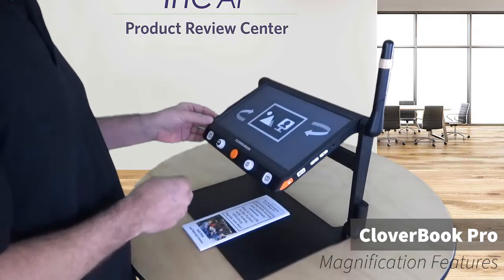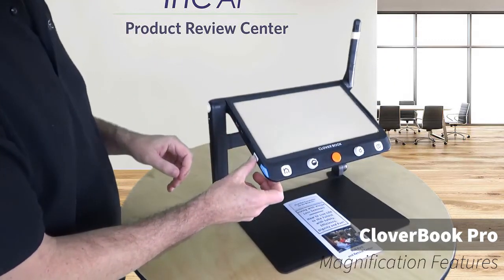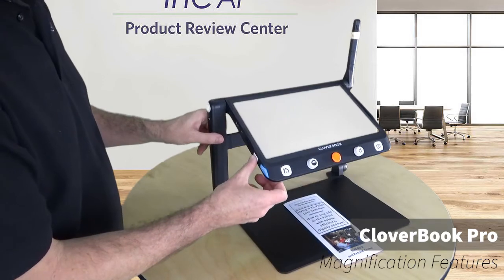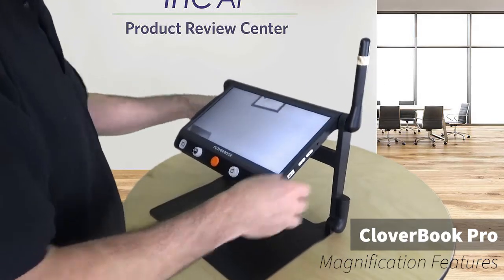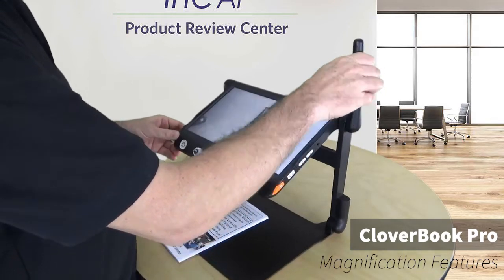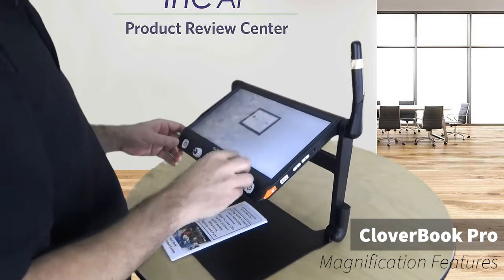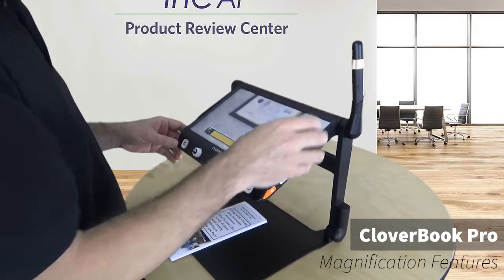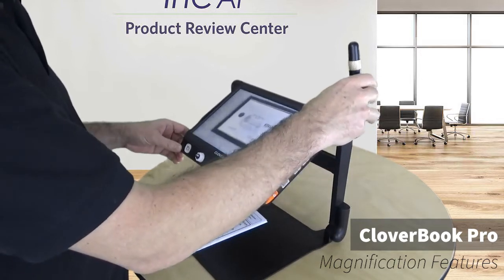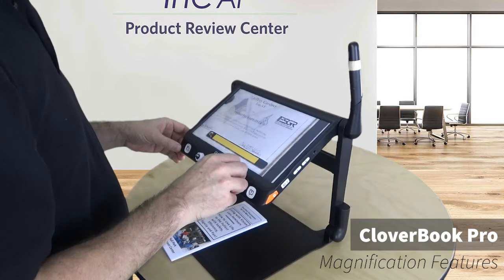I just click a little button on the side here. On the left side there's a small white button. You can press that and it switches to your different camera views. Right now I've got a view of the wall there. Try to line this up so you can see it. It's kind of cool. Again, you can tilt this and get that perfect view that you want. And I can zoom in there and get a nice distance view.